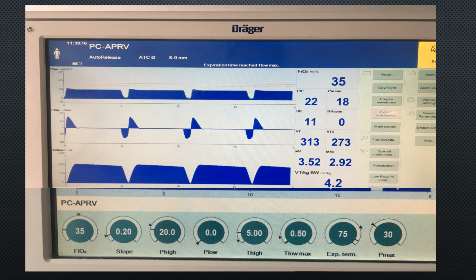You can see on the graph here, on the peak airway pressure graph, that unlike pressure-controlled BiPAP or spontaneous breathing modes, the time spent at maximal inflation is much longer than the time deflated. This allows improved lung recruitment and oxygenation. It is important that spontaneous breathing is maintained throughout this mode to ensure carbon dioxide control.